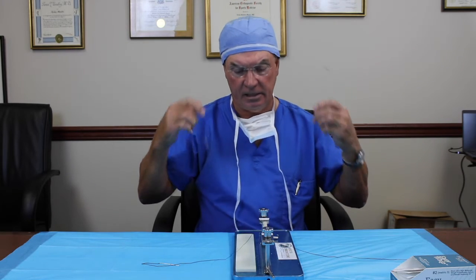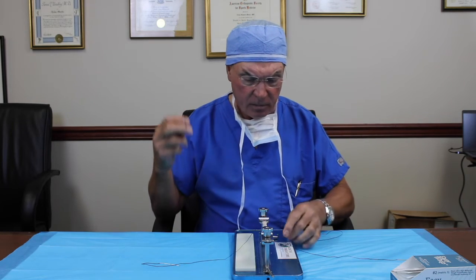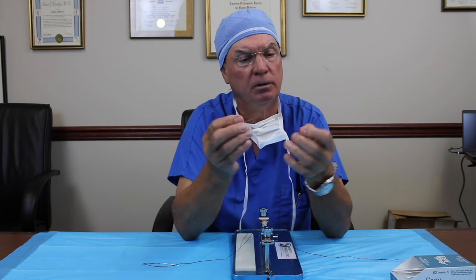The beauty of it is it's now distributing the force over the tendon, and it's not ripping the tendon, which sometimes we get in trouble with. So I think strength-wise, pull-out strength-wise, it's excellent. So I think you might want to give this a try to speed up your stitching of your tendons in the OR.